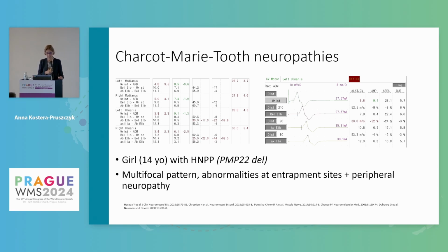So this short nerve conduction study with a typical pattern of two slowings at the distal part of a median motor nerve across the elbow of both ulnar nerves really fits with the diagnosis of HNPP.